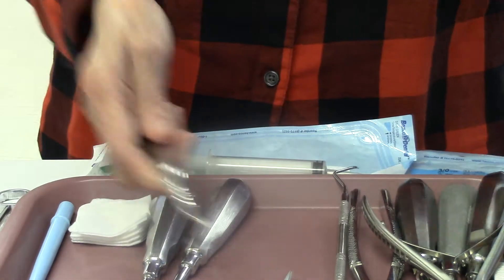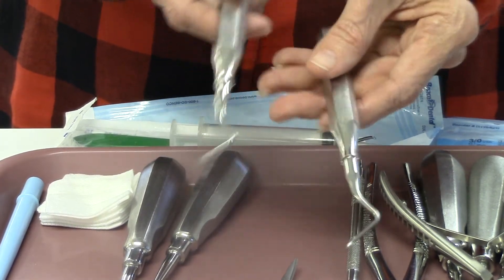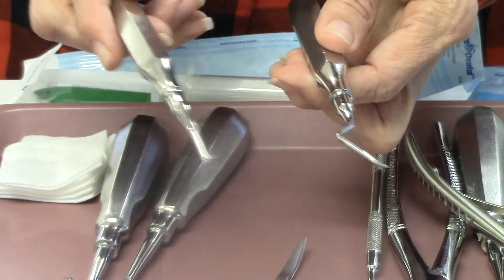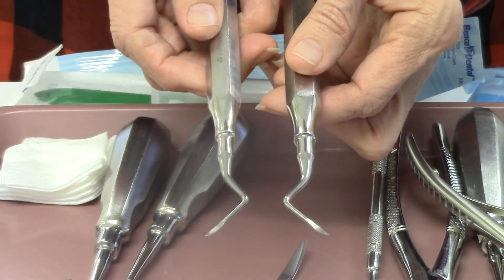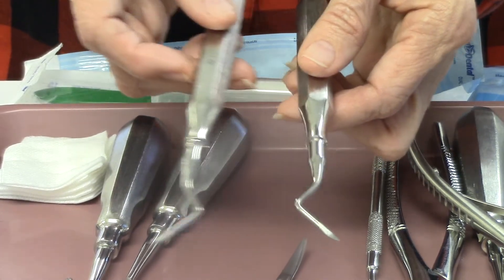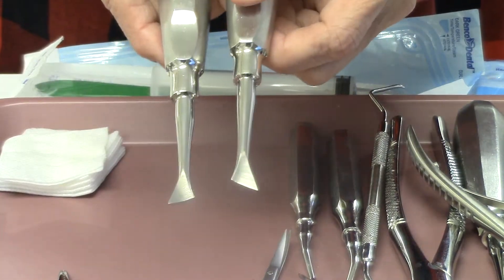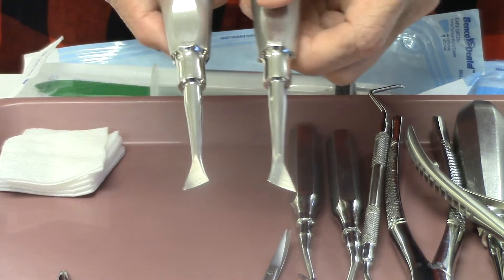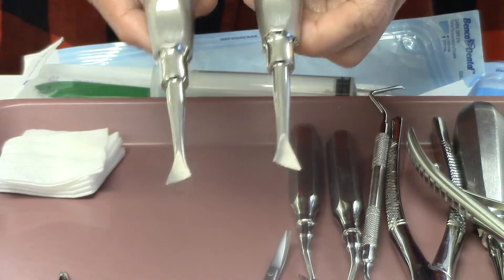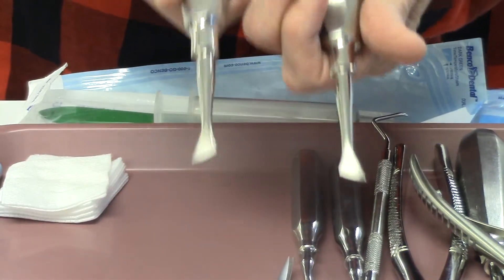Sometimes the tooth has broken off, and for that we have root tip picks. You can see by the shape of them that one goes in one direction and one the other — they are left and right, corresponding to the lingual or the buccal-facial side. These instruments work the same way — they go left or right in opposite directions. These can be called flags or criers. People have a lot of different names for them, and I always think of them as criers because they look like they would make you cry.